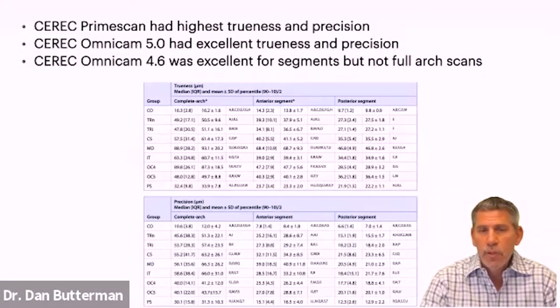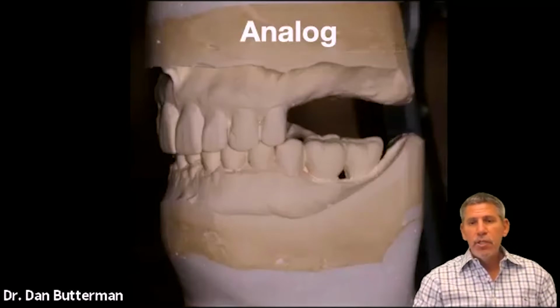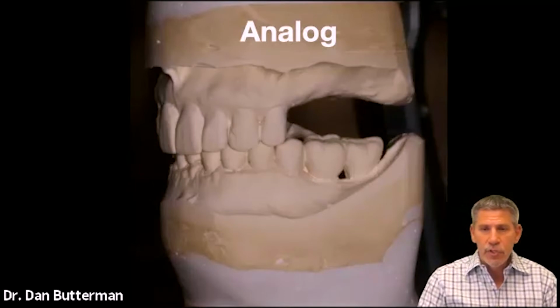But if you're going to be doing more larger cases or full arch things with implants, then we need to move up in technology and software, and you can achieve those sort of things. So let's take a look at a typical analog workflow that most people are doing in their practices. And this happens every single day.